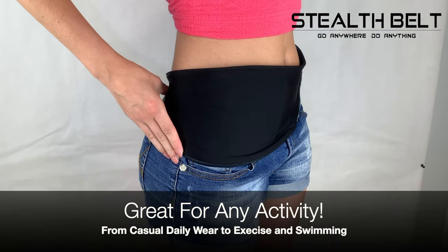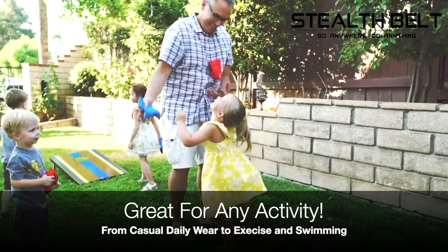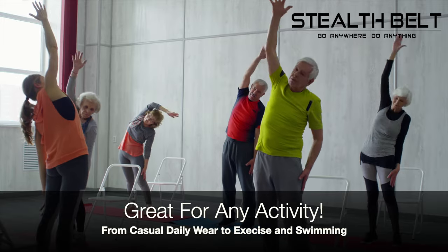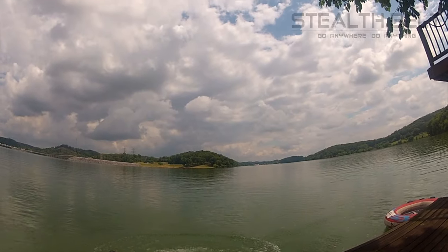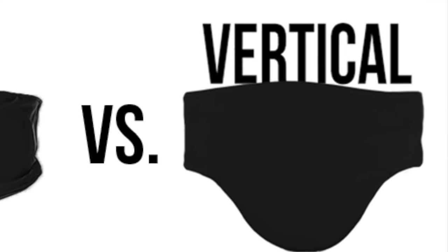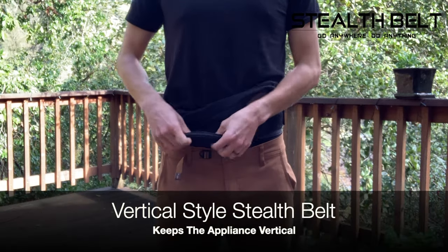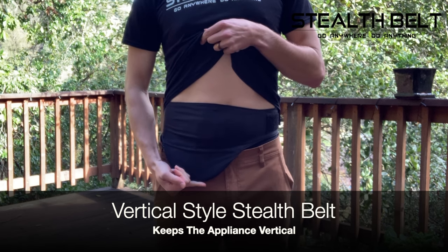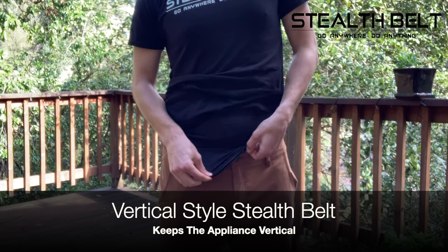The Stealth Belt Pro can also be used for almost any activity, ranging from casual daily use to physical exercise and swimming. Next is the vertical style Stealth Belt, which is designed to be the same as the Stealth Belt Pro, with the exception of its extended zippered pouch compartment, which allows the ostomy appliance to be worn vertically for those who prefer to keep their ostomy worn straight up and down.